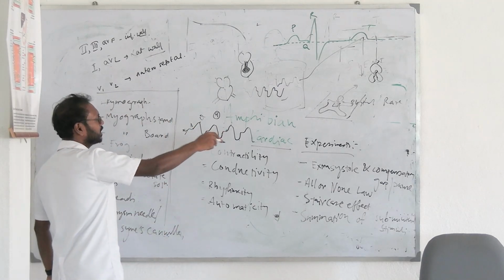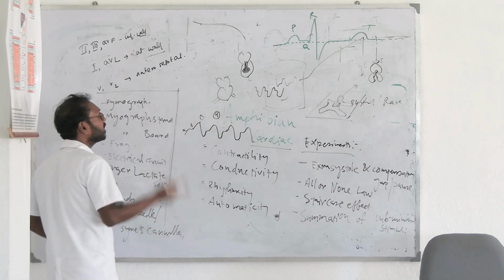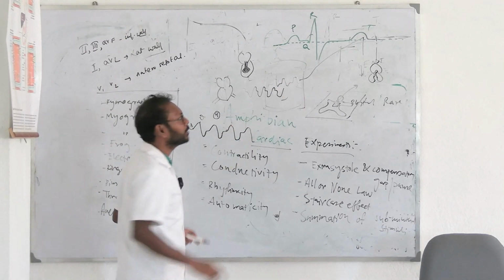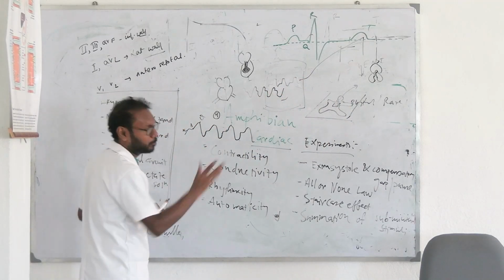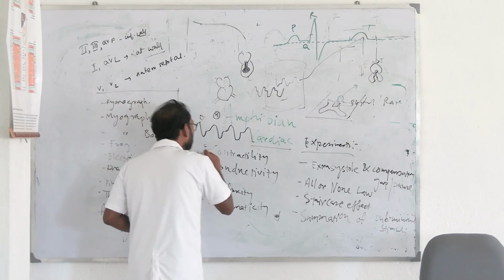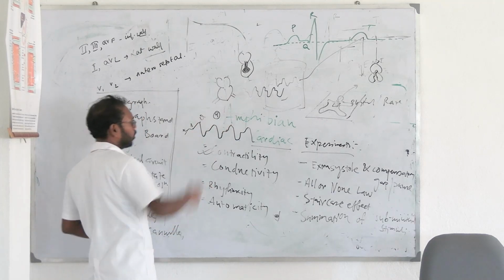So now we will be seeing how this graph actually shows the properties. So first point, contractility. Contractility we already noticed. If the heart does not contract, a graph will not form at all. So we are seeing the contractility. We can see the heart beating, contracting and all. So the contractility part is proved because of the formation of this graph. Because if the heart wasn't contractile, no graph would have been formed.